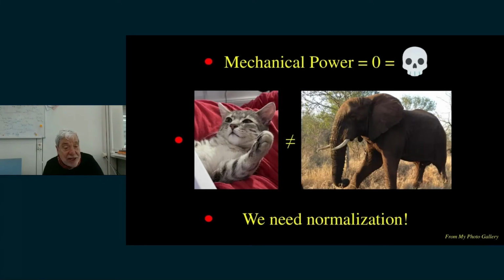We need some energy because if we have zero energy, we die. But we need a normalization. And experience has a good way to normalize what I expect in terms of normal total ventilation. And I think to have a reference, if ventilation is 2, 3, 4 times, it might be dangerous in that particular range.